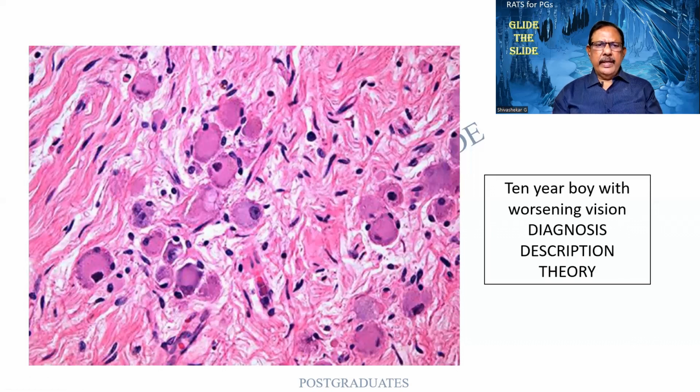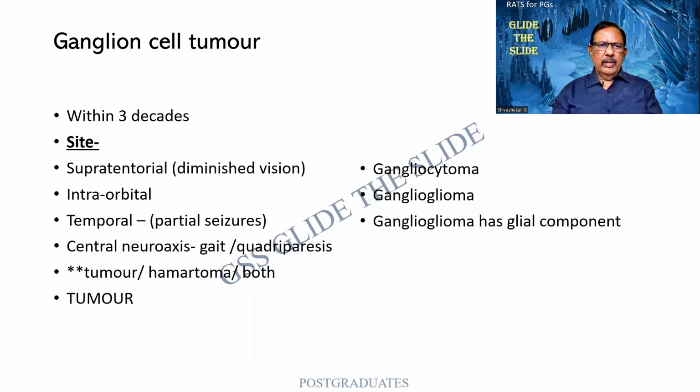If I look at it very carefully, there is a third component that is in total disarray, haphazard. They are also fibers. So this can be a normal nerve bundle. This can be something resembling the Purkinje cells or the ganglion cells. So the diagnosis can be the ganglion cell tumor.